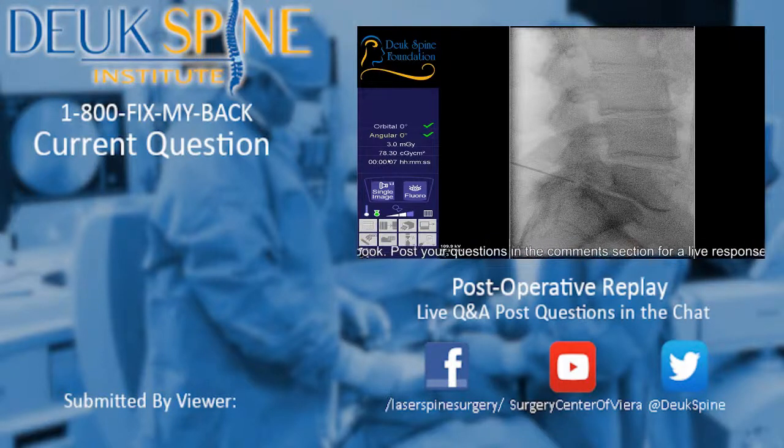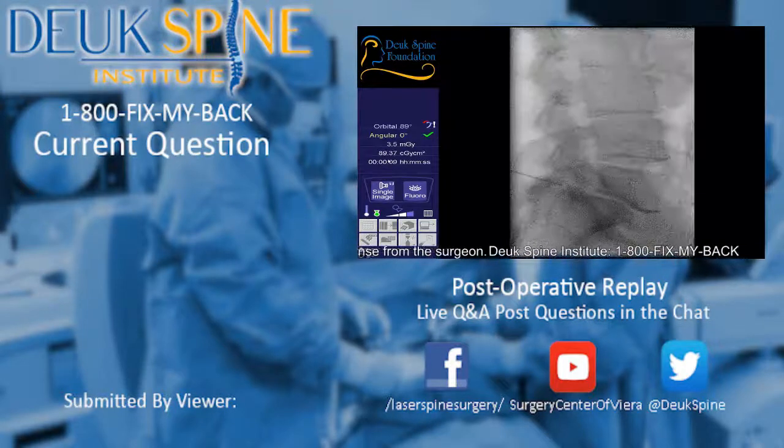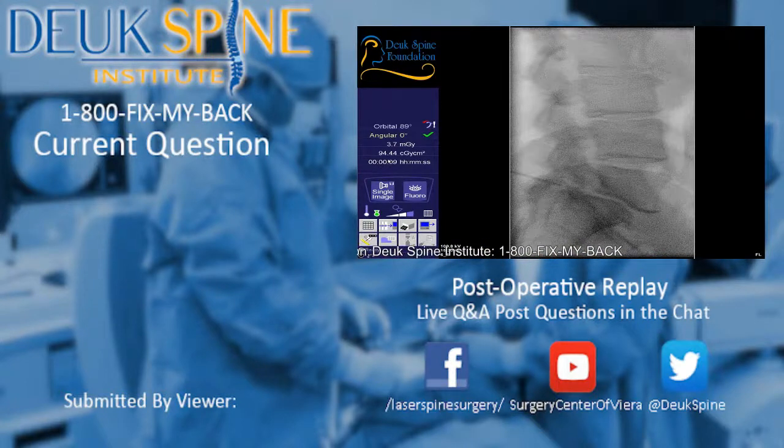Then there's Deuk Laser Disc Repair, what this patient had. Endoscopic surgery, and the surgery is done with a tiny little cut. It's the smallest incision of all spine surgeries, and there's no bone removed. We're going from the side, so there's no removal of the lamina, there's no pars removal, there's no removal of the facet joint. None of the bone things in the spine that hold your spine together are touched, because we go through a natural hole that's already there, so we don't have to make a hole in the spine.